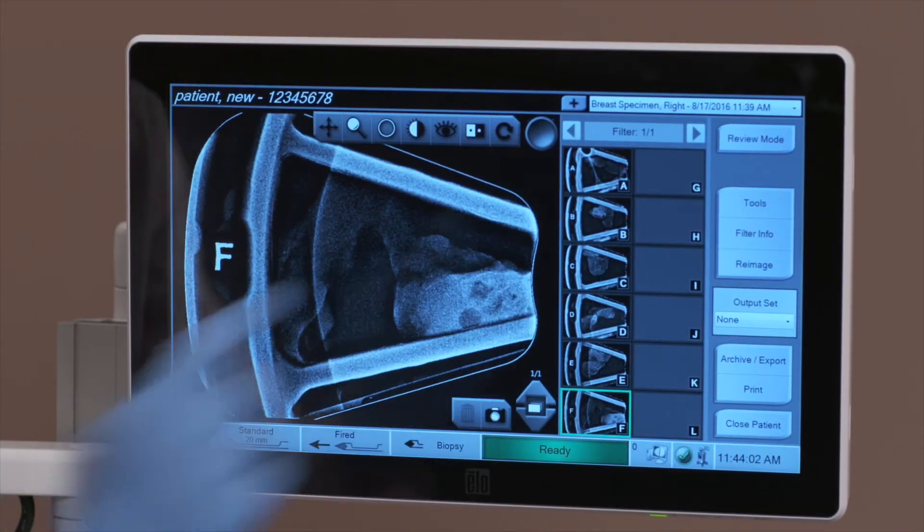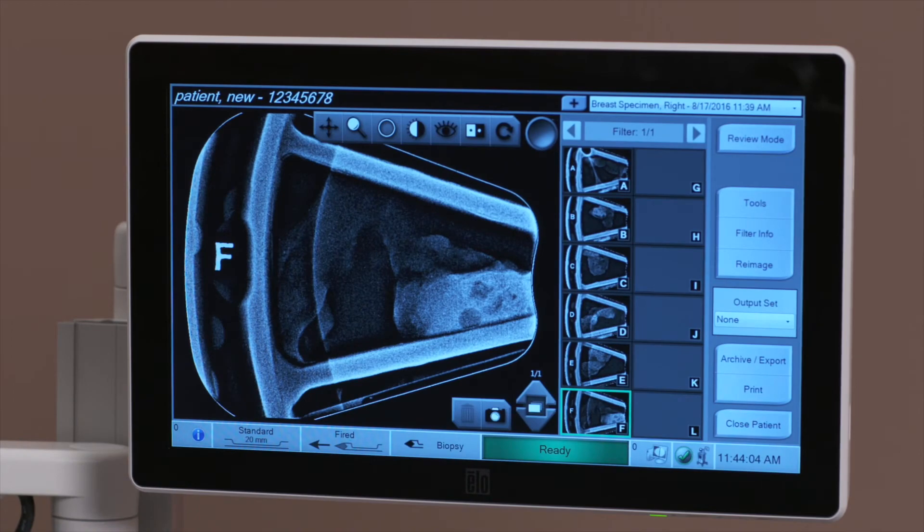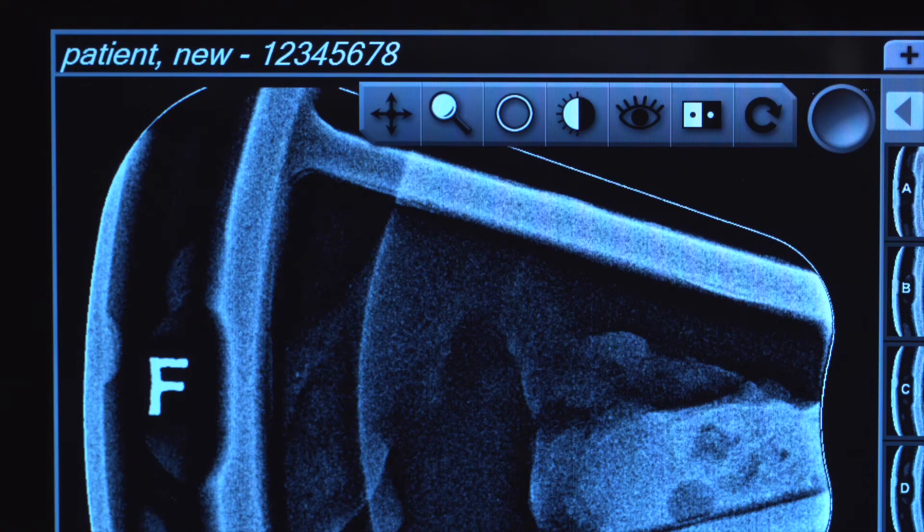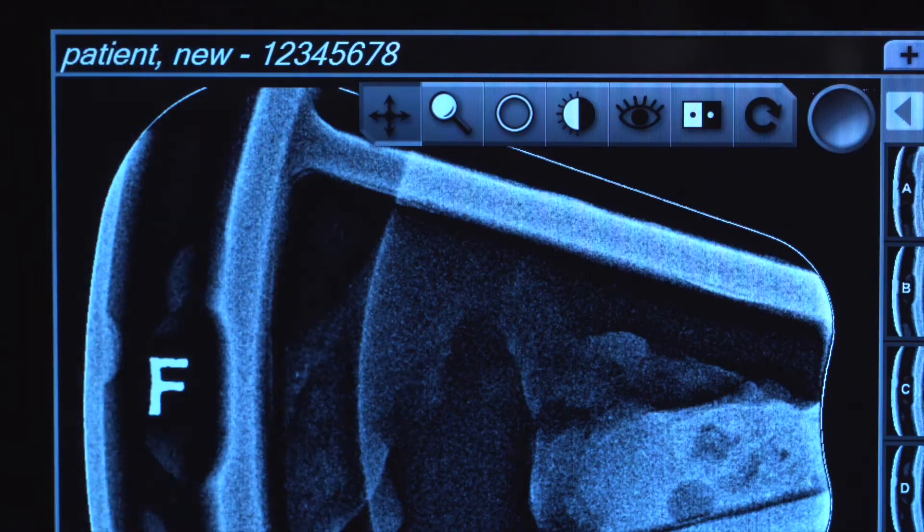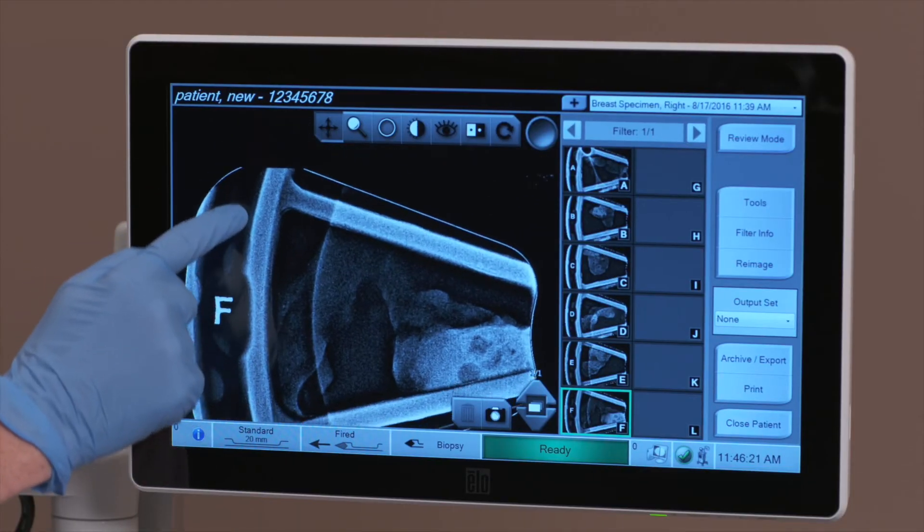Select the tools button to access the image review tools bar which contains several additional imaging tools. Starting from left to right, there are several tools the physician may opt to use. The pan tool is used to move the view to a different portion of the image.